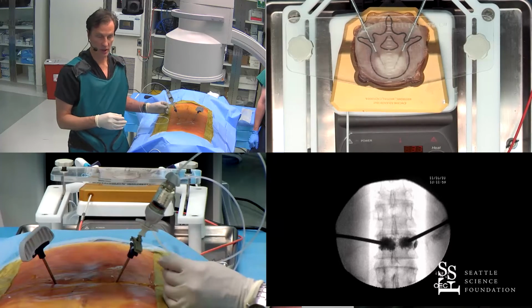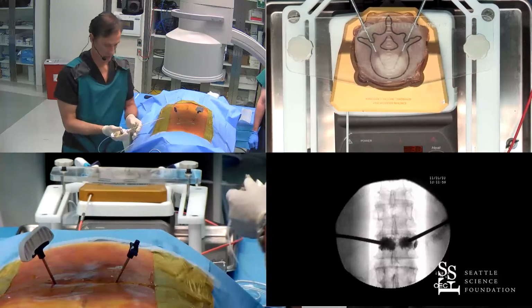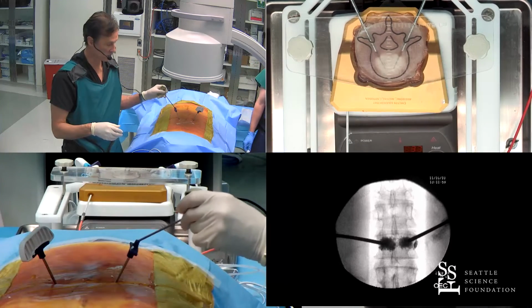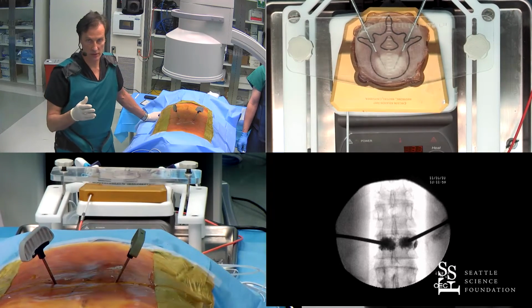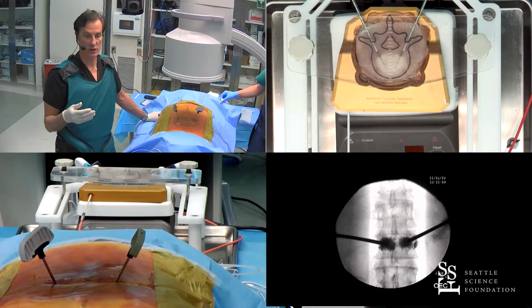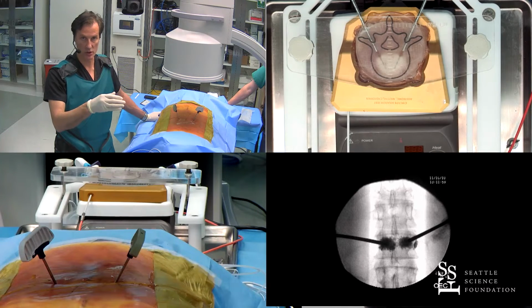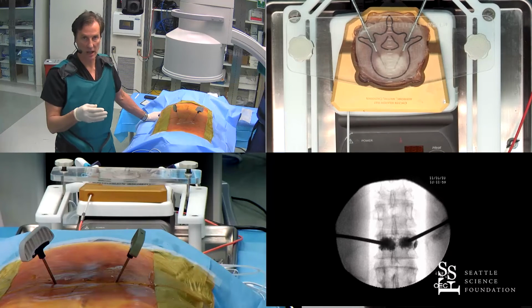Excellent. Questions, comments? When we're dealing with more of the maybe mid to upper thoracic, do you prefer a particular approach? So I like parapedicular approach for the mid to upper thoracic. A lot of times the pedicles are very thin once you get superior to about T10. Sometimes the pedicles are very difficult to access or impossible to access. Parapedicular approach is preferred in the thoracic spine. In the thoracic spine, you go along the costovertebral, costotransverse junction, costotransverse followed by the costovertebral junction. Just over the top of that, that's a path of least resistance into the vertebral body. This is how it should be done.